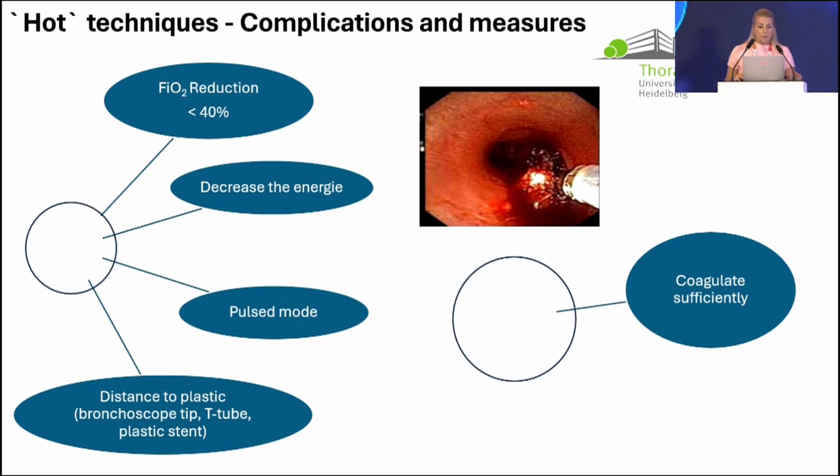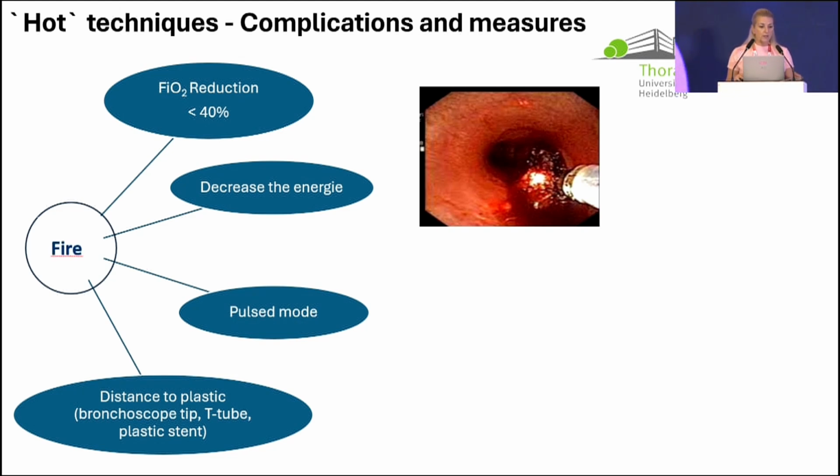These techniques have complications. Looking at this one, first of all, the hot techniques: we have to be really careful about FiO2, keeping it lower than 40%.